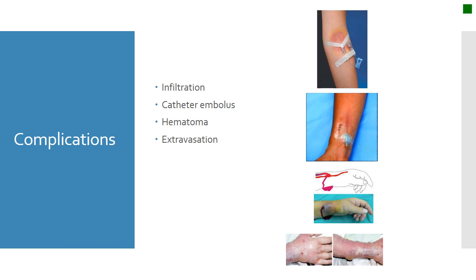So monitor the site closely and frequently so that you see this early if it happens, and use an IV pump whenever possible. In real life, especially in the ER, you hang it through gravity or dial flow, or you do it by eyeball with your clamp, but you always need to be checking that site frequently.